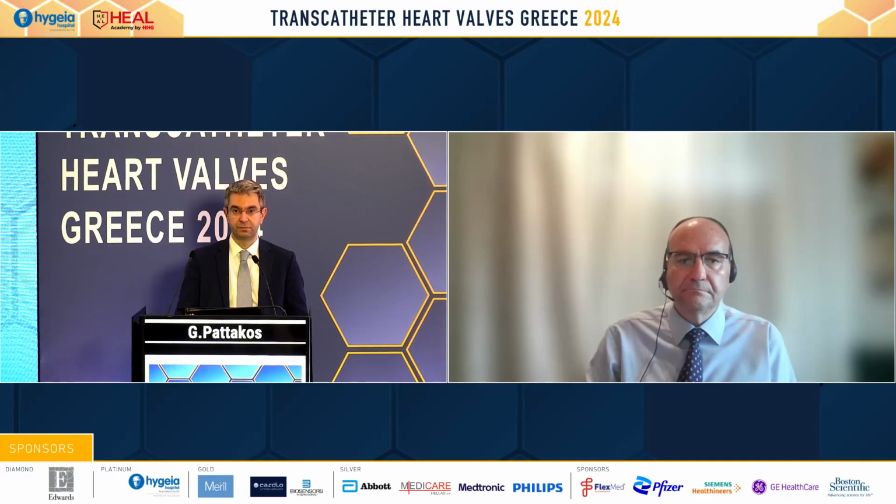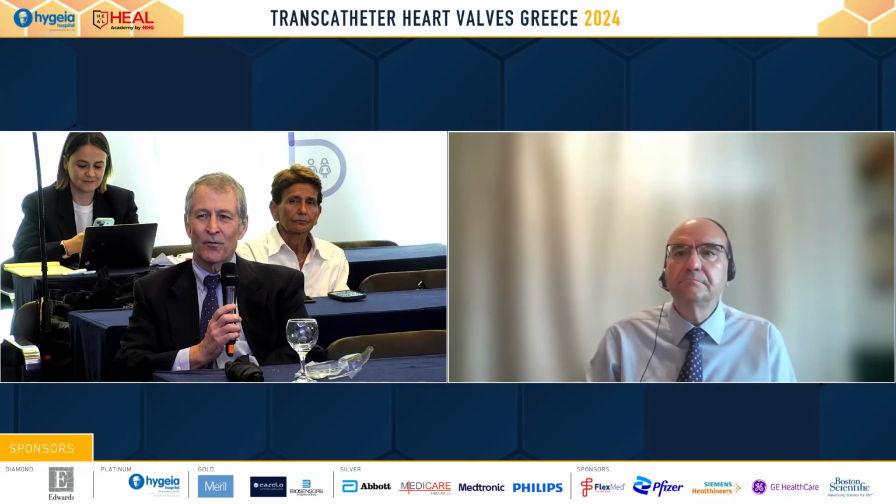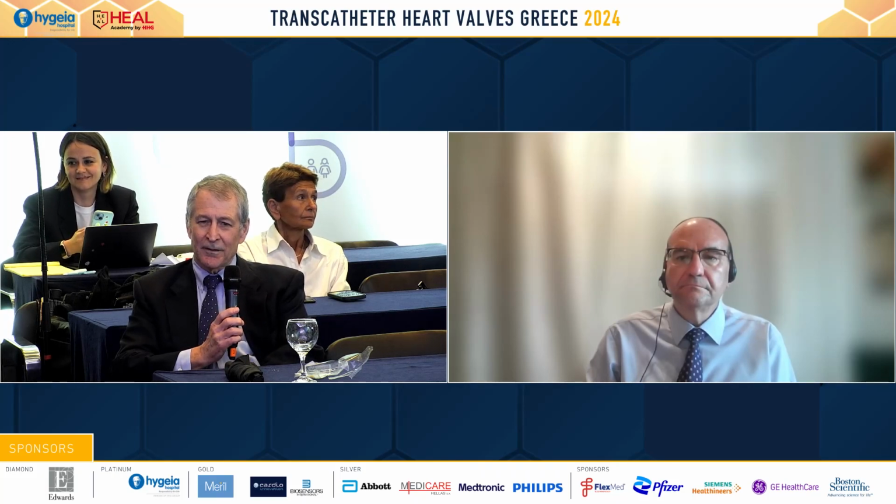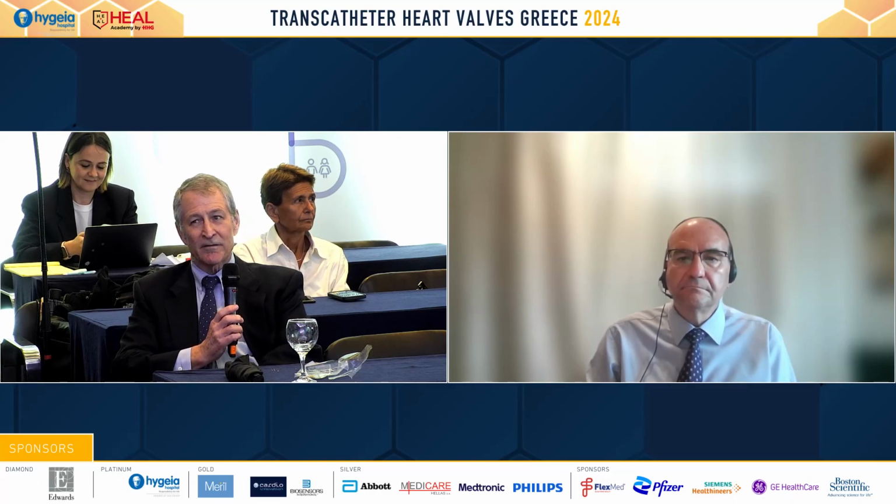It's also changed, Greg, with the Y annuloplasty. So we used to do Nicks and Manougian. You could go up one valve size. Sometimes you could force it to. You do a Y, always 2, usually 3, and Bob often goes up 4 sizes, which I think is a little crazy, but in the Evolut Low Risk, my annular enlargement rate was 5%. In my practice now, it's 46% because of what we can do.